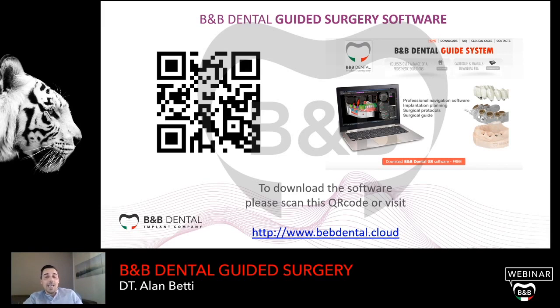This is the website where you can download our software. You can also find this link on the B&B Dental website, www.bebdental.it. You can find the window about guided surgery and the link to download the software.